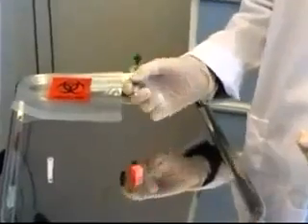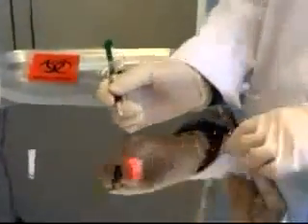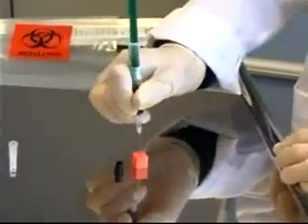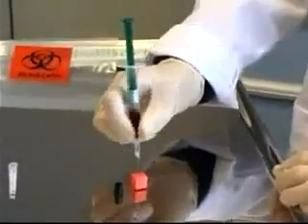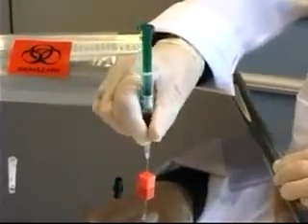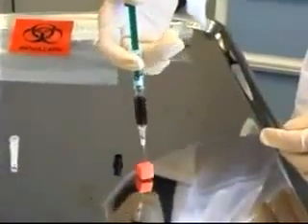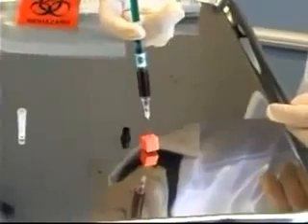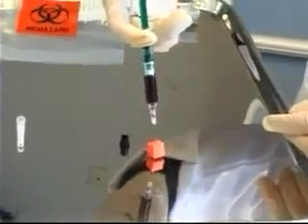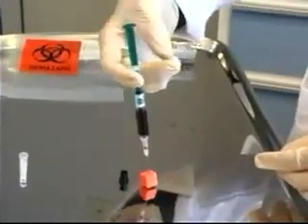While my patient is holding pressure over the site, I'm now going to take my needle and syringe over to my air cube and insert the needle straight up and down into the cube. I want to put it in far enough that the bevel is covered, but not so far that it goes right through the entire cube. Once I've done that, I'm going to push down on the plunger, which will expel any extra air that might have gotten into the syringe and would otherwise affect the results.